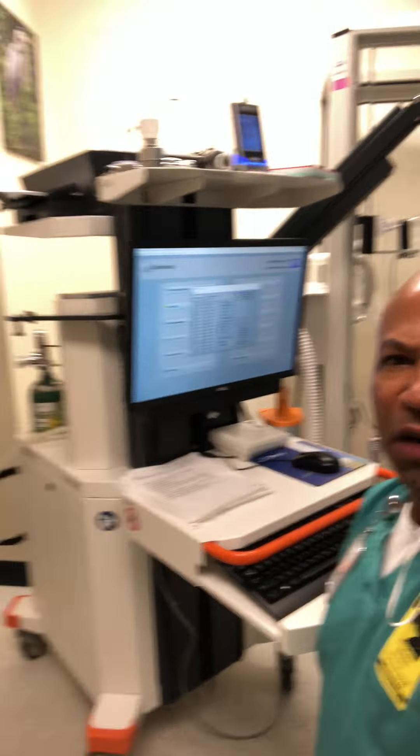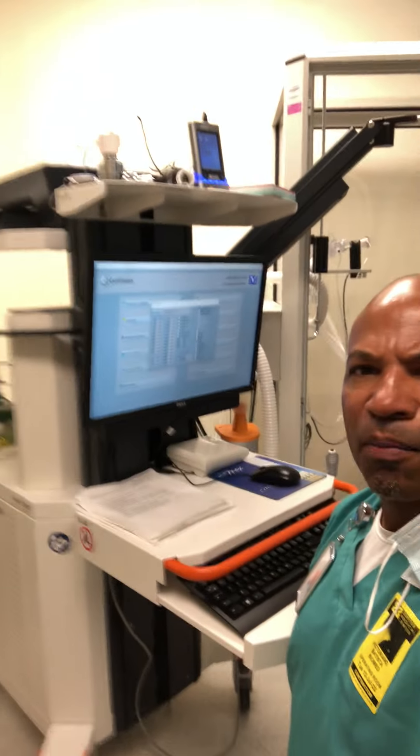Hey everyone, good morning. Just want to go out for a quick tip here on the pulmonary function machine and also the body box, for those of you that are not too familiar. One very important thing for you to notice when you're doing checkout maintenance on these — of course, follow your service manual.